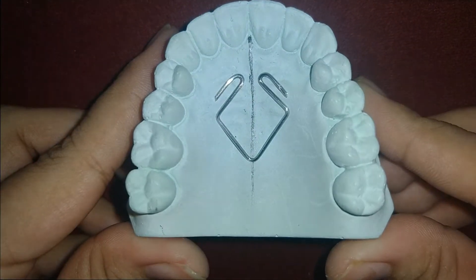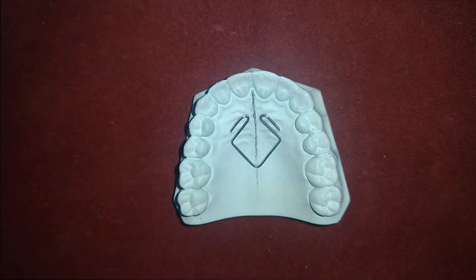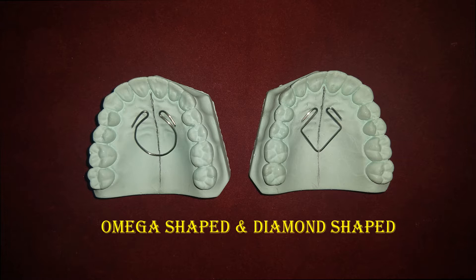Let's see wire bending of coffin spring. Coffin spring is used to bring about slow maxillary expansion, which is fan shape or radial type of expansion. Coffin spring can be fabricated in two designs.